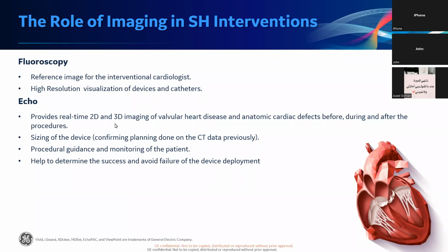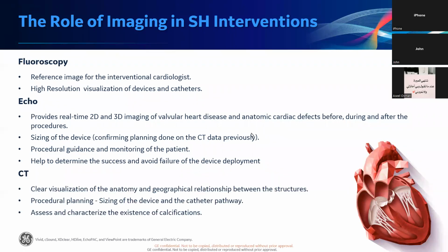Can be an adjunct or sometimes a replacement for the fluoro in the pre-procedure assessment, of course, and even during the procedure for guidance, depending on the procedure. And of course, the advantage of echo, two advantages, of course, over fluoroscopy is the 3D structural or surface rendering and the ability to do 2D slicing in addition to the real-time imaging, continuous imaging, as well as, of course, the obvious, which is zero radiation when it comes to echo.